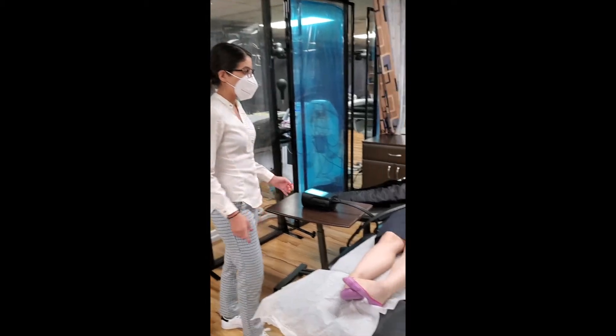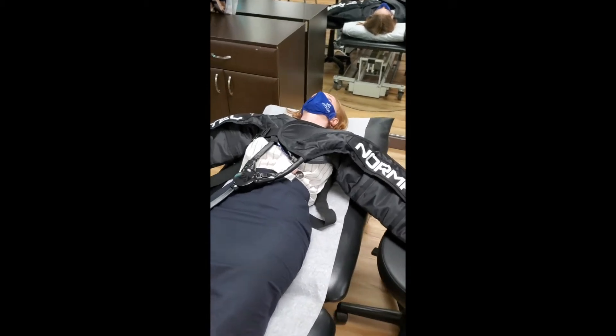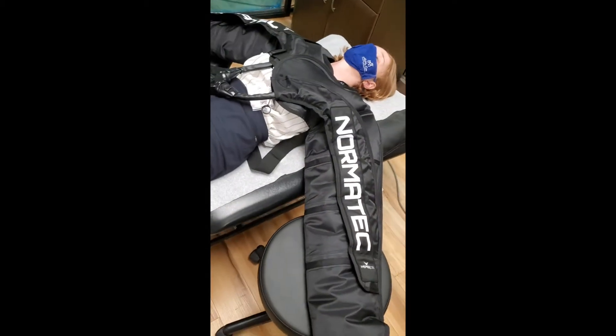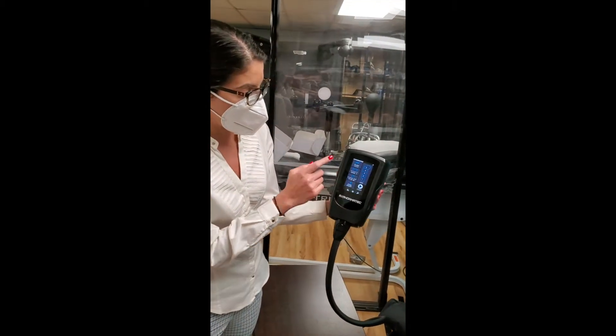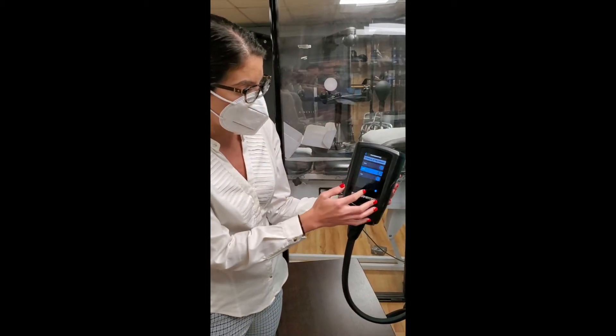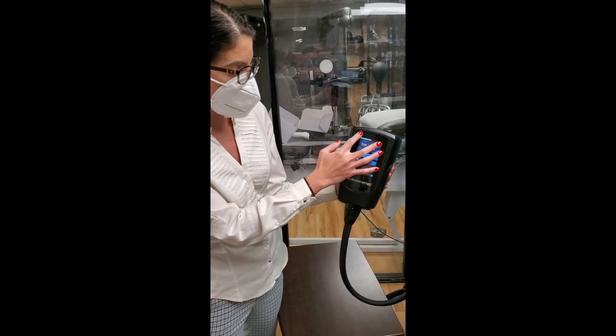Over here I have Charlotte. I've already set her up in the NormaTec for both arms. This unit works for both upper and lower extremities — I could switch it over for lower extremity use — but today we're going to be doing the arms.